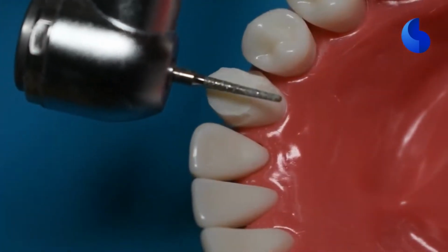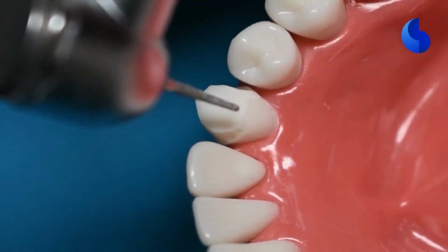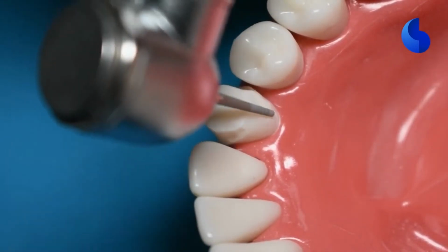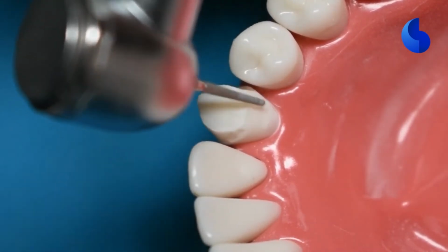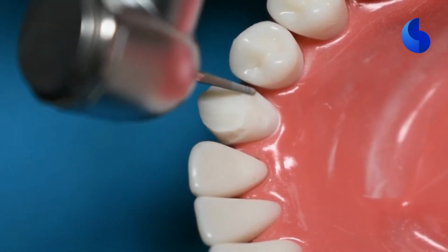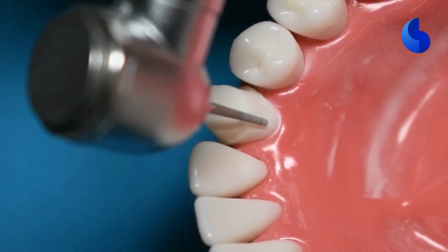So once you've prepared this part of it, you can go on to your lingual reduction, and then we can come back to revisit our proximal surface for further refinement. On the lingual surface, remember that the canine does have a ridge that runs through, so you have to preserve that, and the best way to do that is to reduce one side of your lingual surface first and then move on to the other surface.